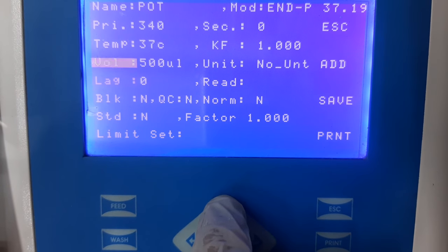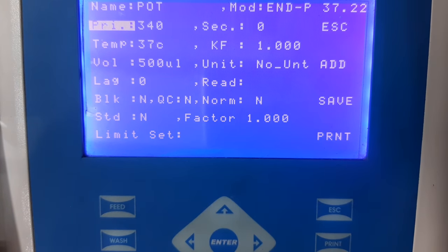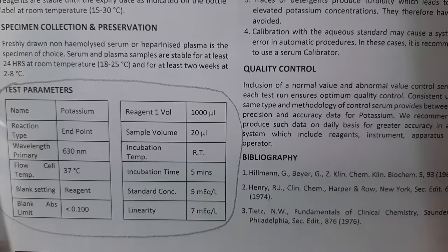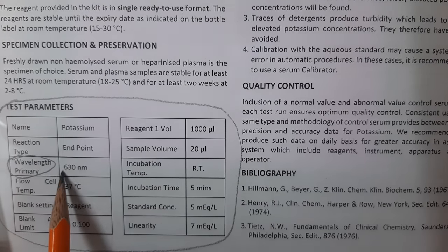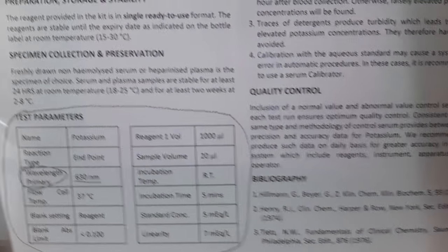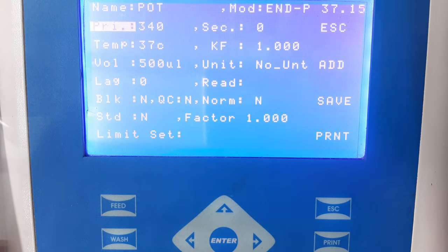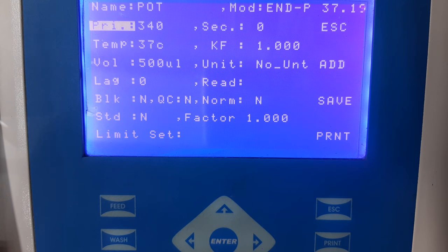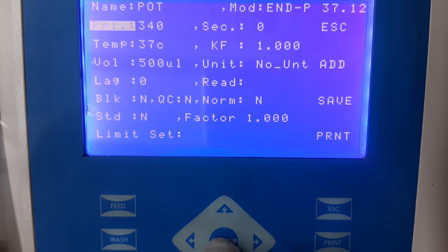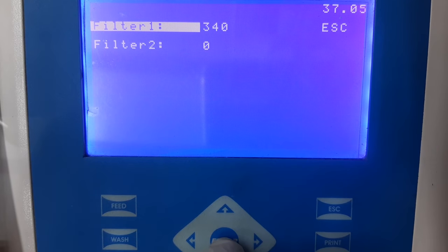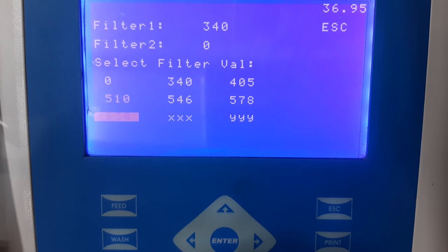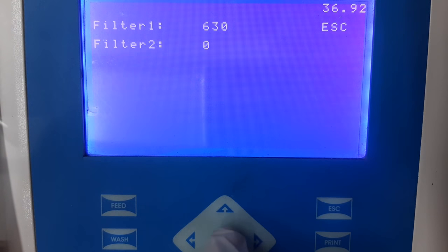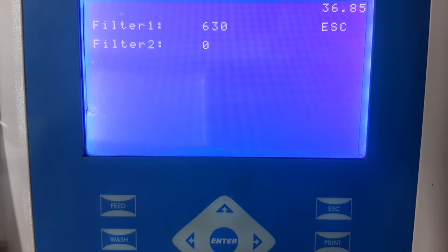The next information that needs to be added is the primary wavelength. This information can be seen in the instructions for use, where the manufacturer clearly mentions at what wavelength the absorbance needs to be taken. Select the option of primary wavelength and then select filter 1. From the list, select the wavelength which is mentioned in the instructions for use, and then press escape to come back to the home screen.